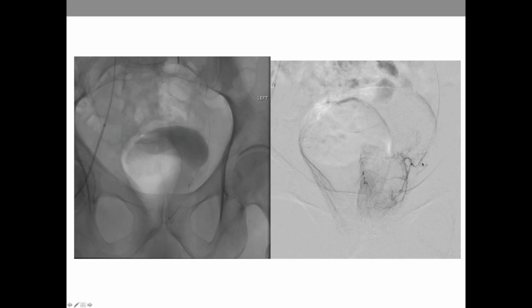Now you might say, well, why do you need a balloon occlusion microcatheter? I thought the whole point was to change the pressure and keep particles going up. Well, this might be a different usage. And so what this is actually more of a high pressure embolization. So before we were counting on flow from below to come up and drive the particles into the prostate. Now we're just basically pushing particles in, but we can do it at a higher pressure because we've blocked the outflow. And so that's what we did.